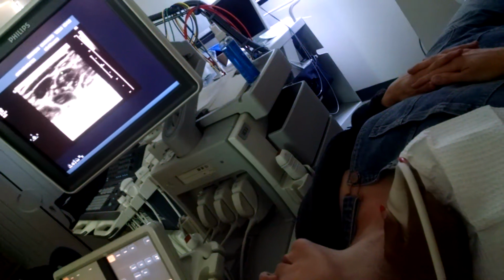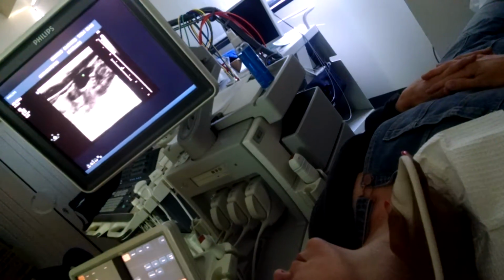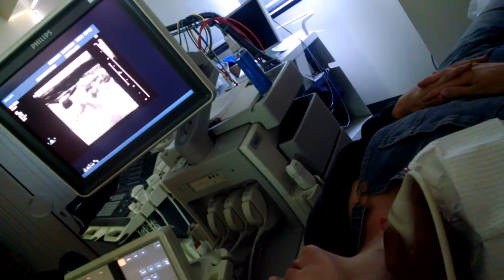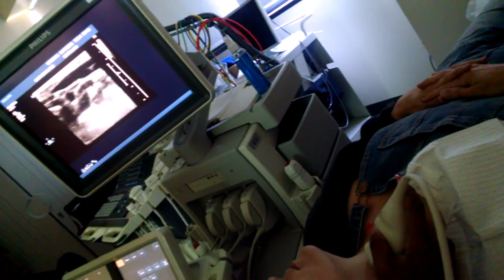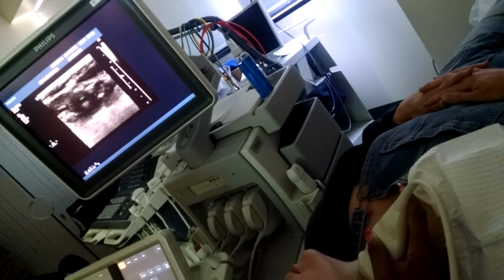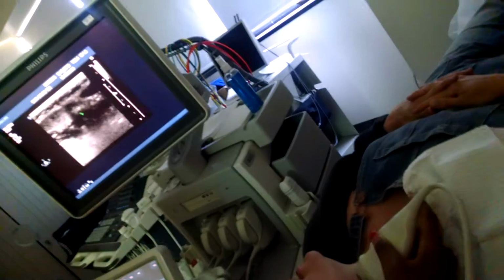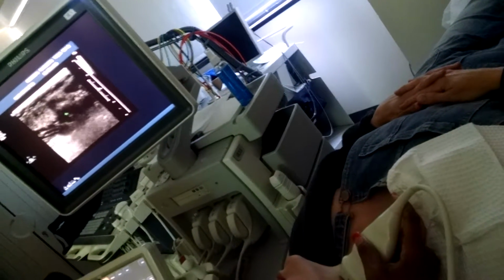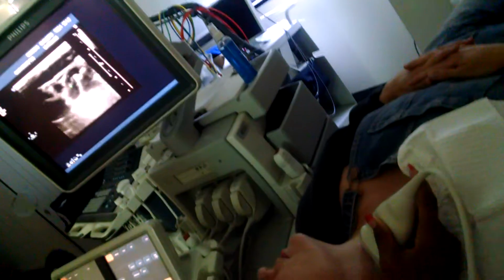All right, so then I'm just going to move cephalad up towards the bifurcation. And now the bulb is coming. Not very pretty from this approach. And then I have the bifurcation. It just depends on everybody. Some people have beautiful anterior, some people have better lateral. It just depends on their muscle.